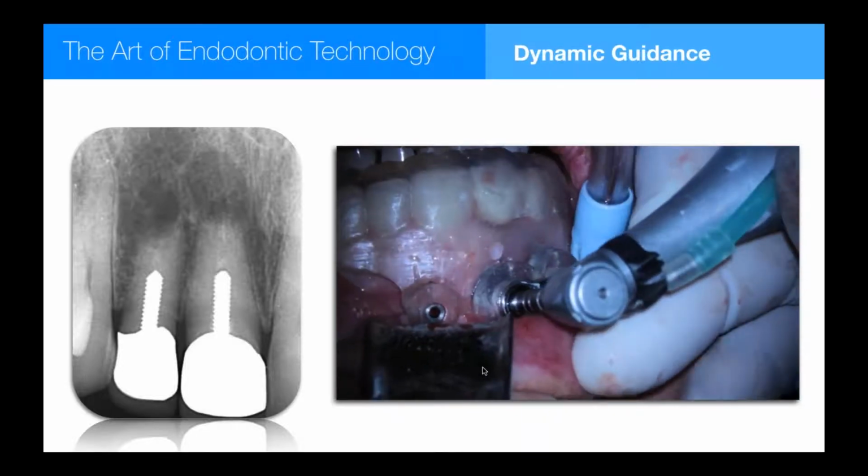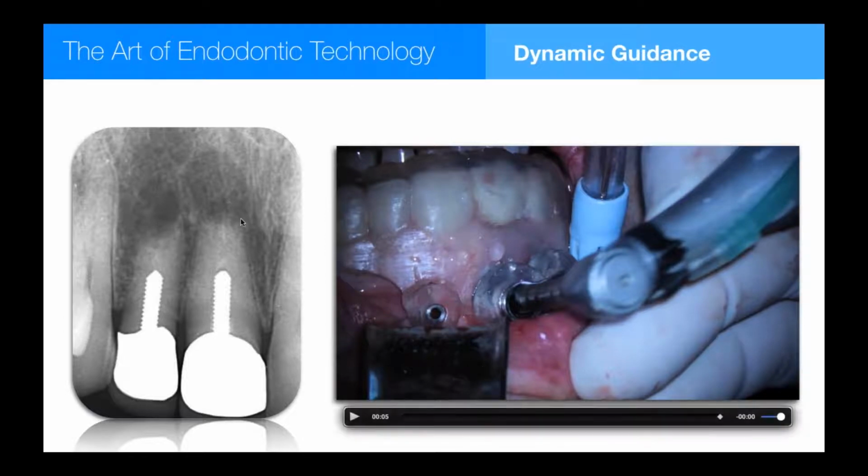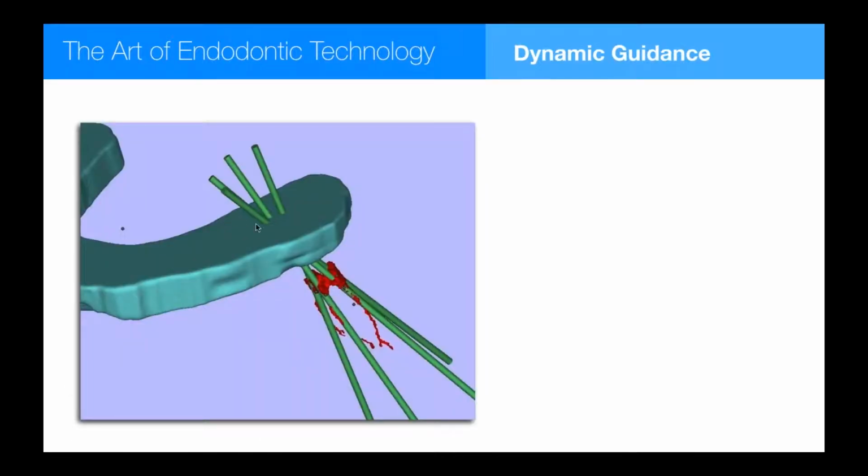Here is an experimental procedure I was doing using drill guides for apical surgery. You can see 2 well-restored posted teeth. Instead of trying to retreat through the tooth, we're going to just cut a very precise opening at the apices of both of these teeth and shorten the procedure, reduce the post-op healing, discomfort, etc. We can also make a drill guide for conventional access.